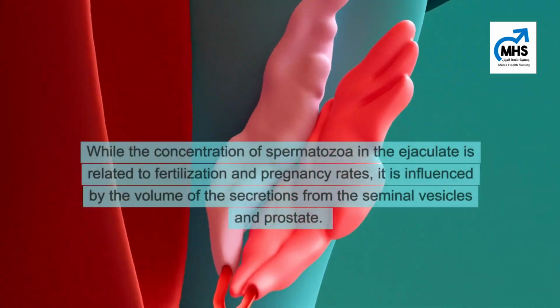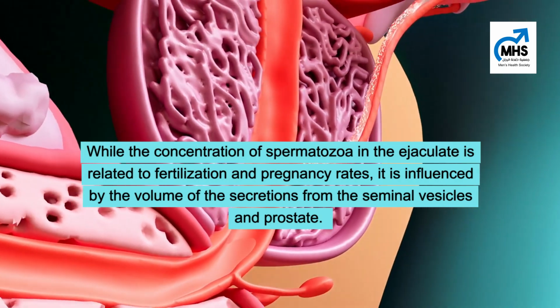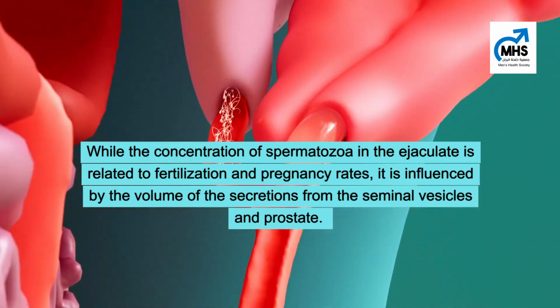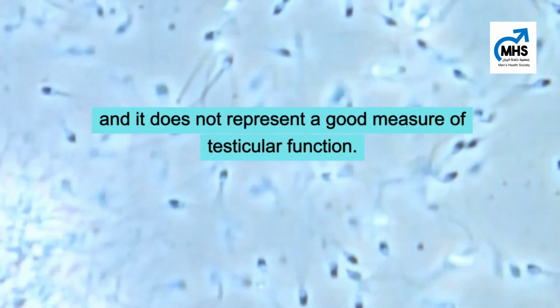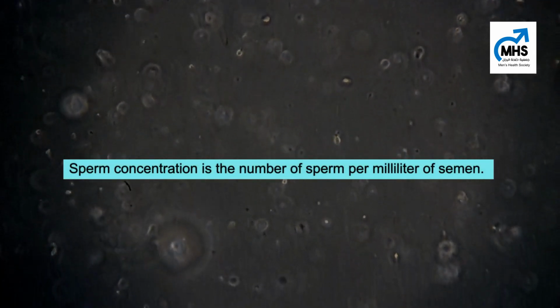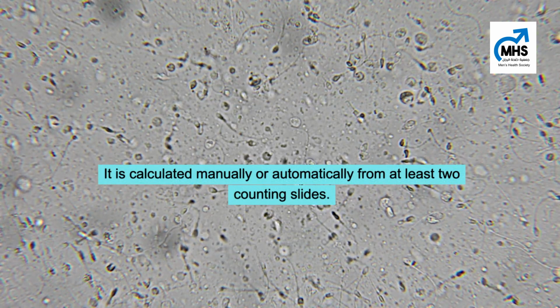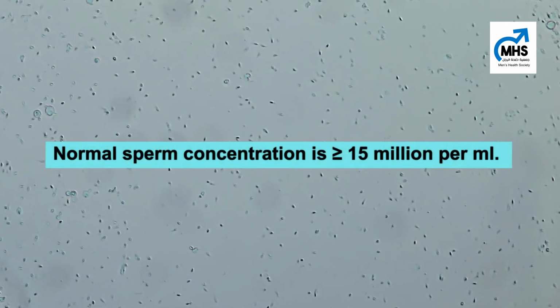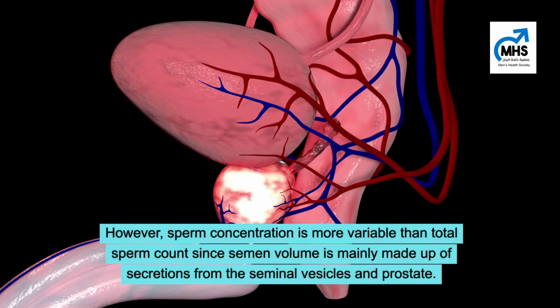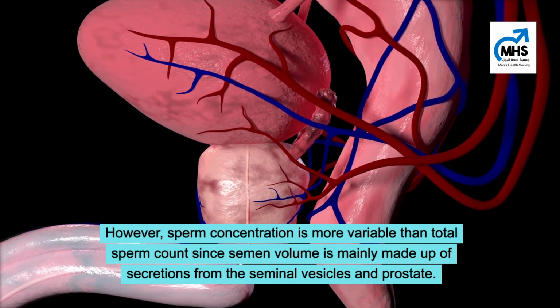While the concentration of spermatozoa in the ejaculate is related to fertilization and pregnancy rates, it is influenced by the volume of the secretions from the seminal vesicles and prostate, and it does not represent a good measure of testicular function. Sperm concentration is the number of sperm per milliliter of semen. It is calculated manually or automatically from at least 2 counting slides. Normal sperm concentration is 15 million per ml. However, sperm concentration is more variable than total sperm count, since semen volume is mainly made up of secretions from the seminal vesicles and prostate.